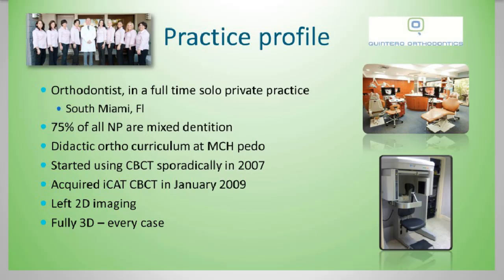It also allows us to understand the TMJ status of every single patient before we start treatment. While it does have its limitations, we get to see the hard tissue information of the temporomandibular joint, that is the condyle and the fossa. So we can screen, very importantly, for cases that have underlying degenerative joint disease in an active or non-active form. What's interesting is there are a lot more DJD cases out there than we ever thought. And the scary part is that many of these cases are flying under the radar because they're completely symptom-free. So it allows us to screen for arthritic joints, arthrotic joints.